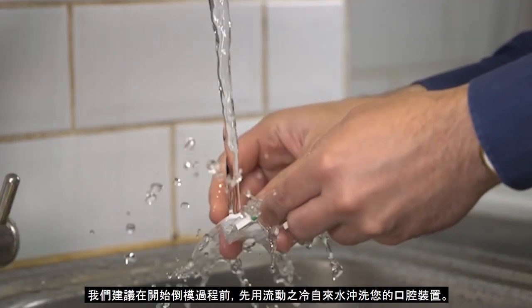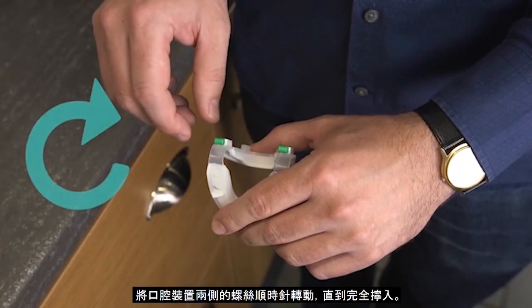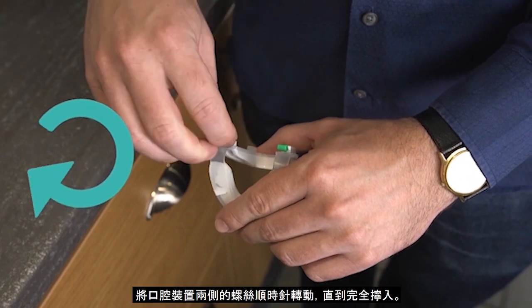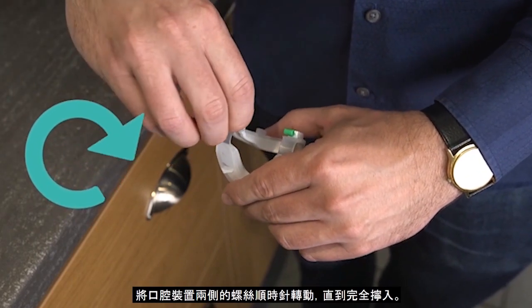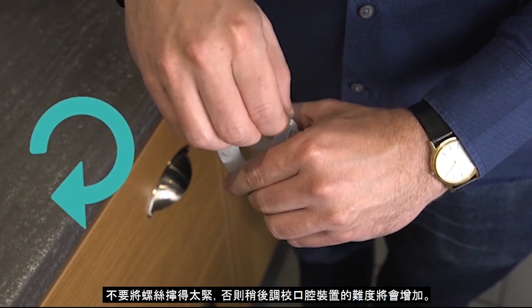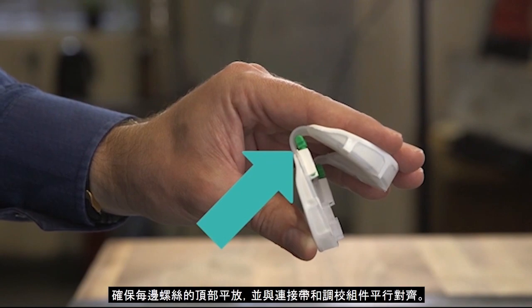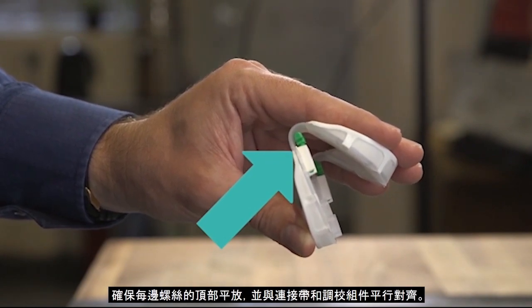We recommend running your Oral Device under cold water before starting the moulding process. Turn the screws on either side of the Oral Device clockwise until they are fully screwed in. It's important not to screw them in too tightly or you will struggle to adjust your Oral Device later on. Make sure the screws lie flat in line with the strap and the adjustment block, like this.